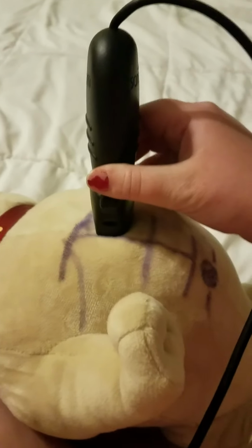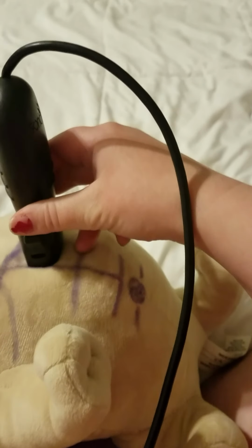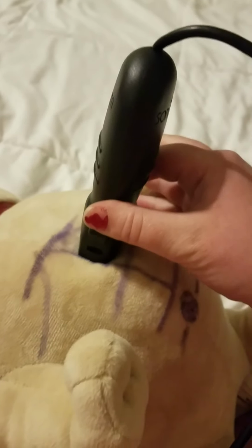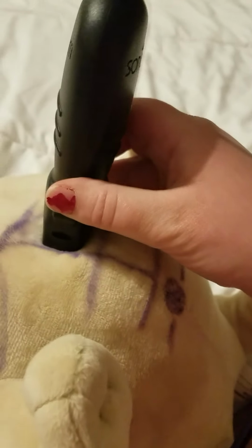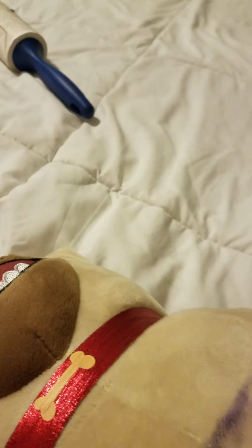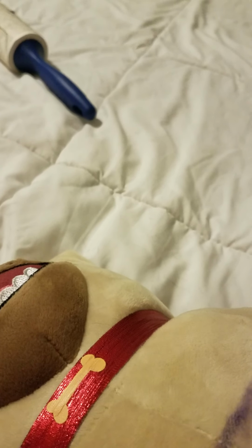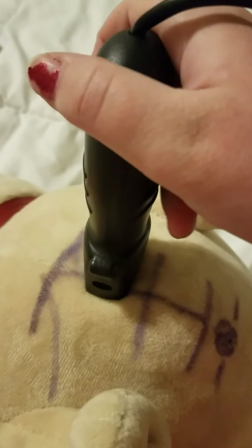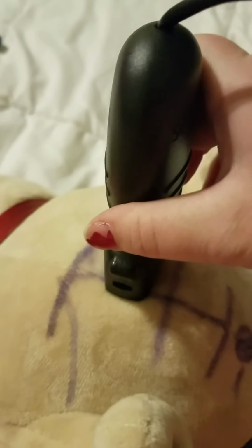You're going to pan slightly down, not to mid yet. We're not there. I know this is a short stuffed animal, but we're not at mid just yet. And then in this short axis, you're going to see that celiac trunk that's going to split off into the splenic and hepatic. That'll be seen in short here, and you're going to see it as a whale tail or seagull. So it's going to look like that. And that's going to be just before you get to your midsection. So some people throw color on that just to see the flow through there. You can throw color on it.